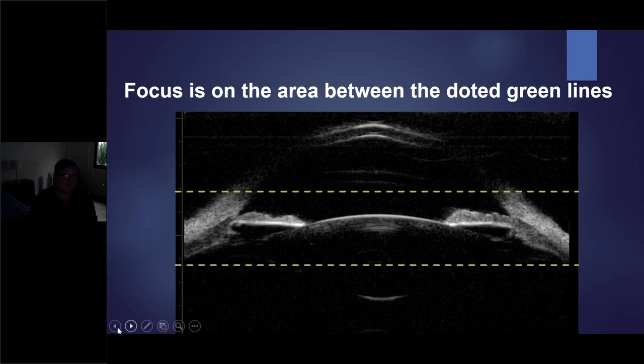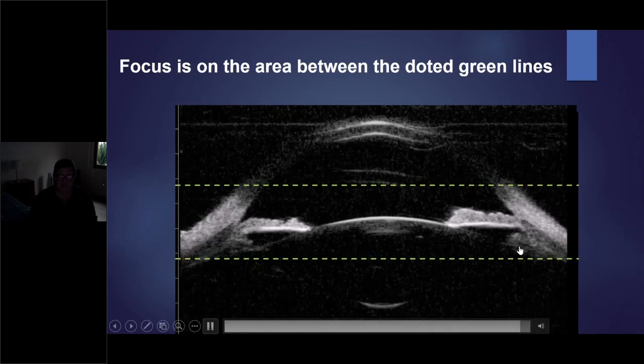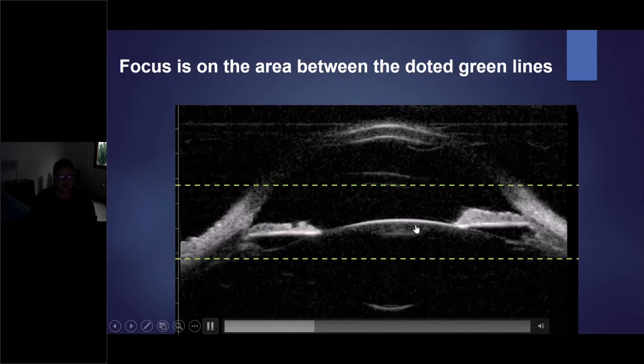Look, when I go up, I am in focus on the lens, the zonula, the ciliary body, the iris. And if I go down, I can see the cornea. I go up, I miss the focus here, but I have perfect focus in the center. But if I go a little deeper, I get focus in this area. It all depends on what you want to see.